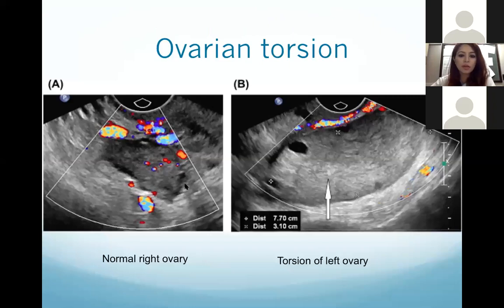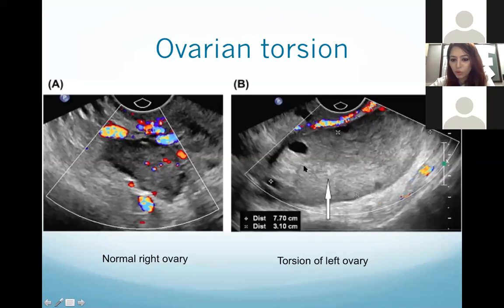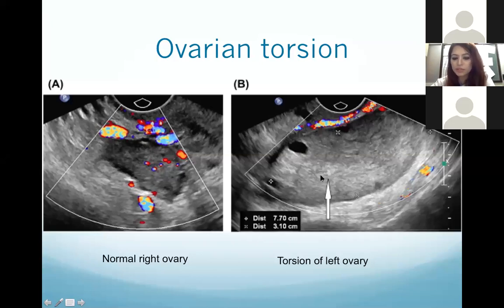Here you can see a normal ovary with normal vascularity — these dots are the normal vessels. This is a torsed ovary: it is enlarged, with follicles at the periphery, a central solid stroma, and no vascularity inside. There is a vessel at the periphery but no vessels inside the ovary. This is an avascular enlarged ovary with peripherally arranged follicles suggesting ovarian torsion.